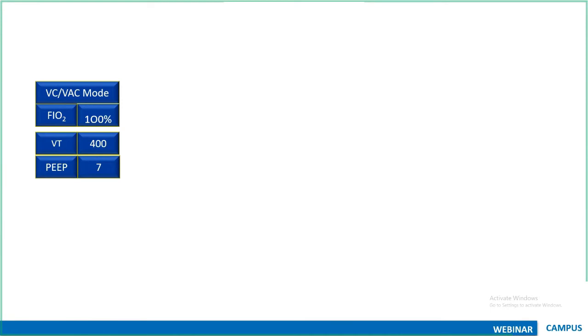I have a COVID patient developing hypoxemia. I started the patient on HFNC with optimal settings. Now the ROX values are coming down to almost 4 or 4.5, less than 5. I've even tried NIV, keeping high EPAP, all optimal settings. Still the ROX values are less than 5. I've decided to intubate the patient.